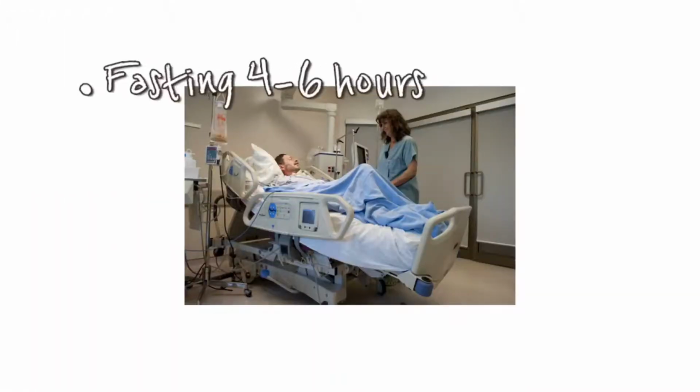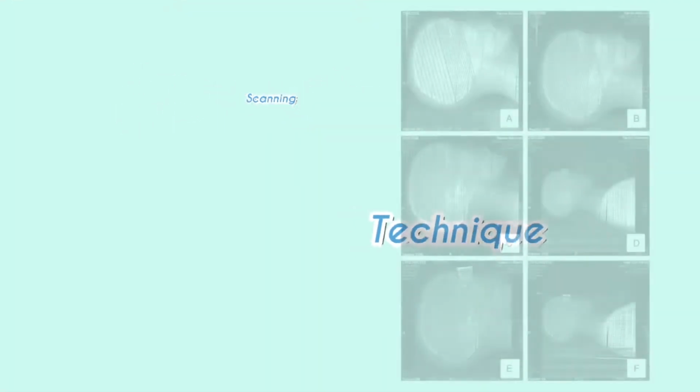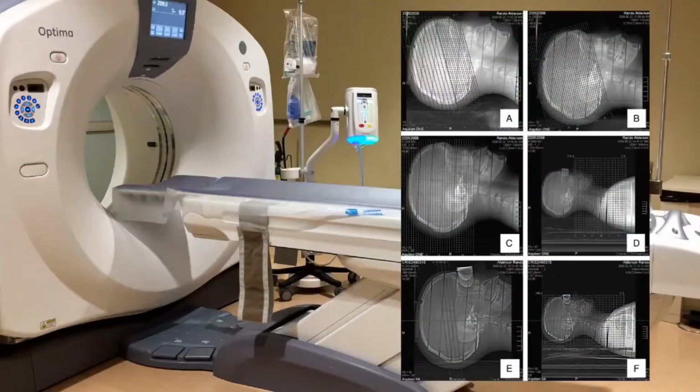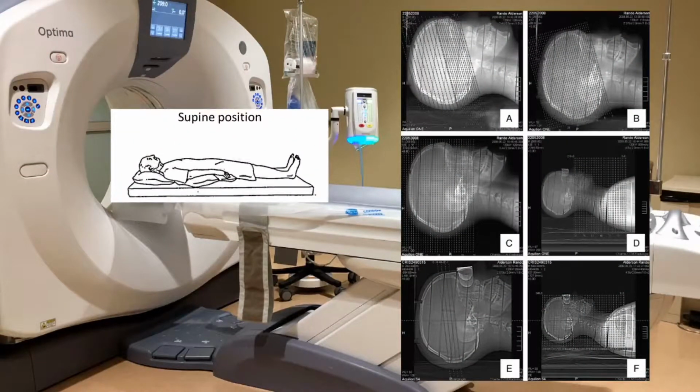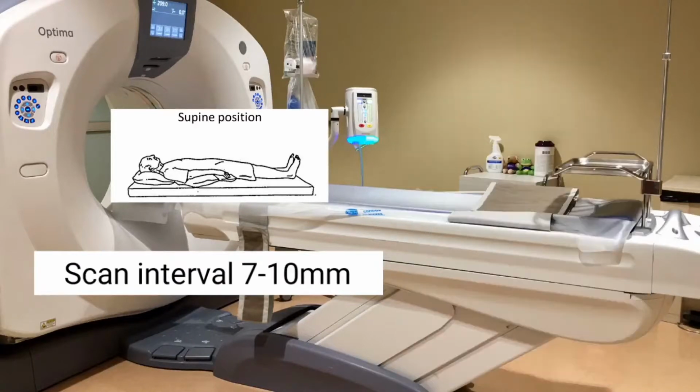Before scanning, patients must be fasting for 4 to 6 hours and injected with contrast agent if needed. The patient must lie down in supine position and the scan interval should be in the range of 7 to 10 millimeters.